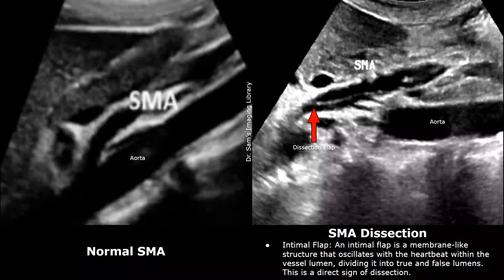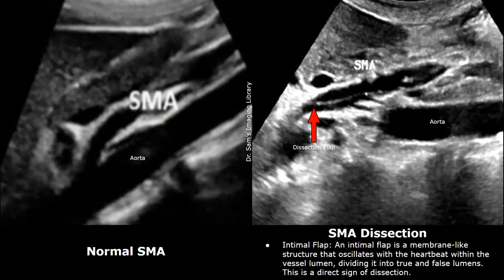SMA dissection is very rare. Dissection is bleeding inside the lining of an artery where the inner lining is torn. On ultrasound, a dissection will show an intimal flap — this thin, linear echogenic structure within the anechoic lumen of the SMA. This is how a normal SMA looks with an anechoic lumen, but here we see a thin intimal flap within the artery.